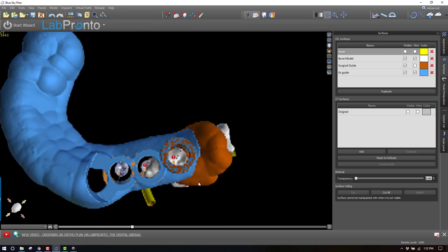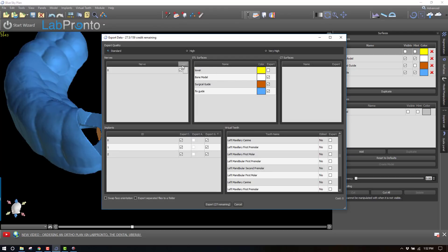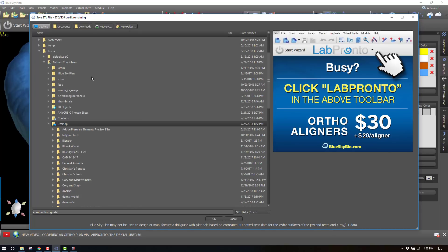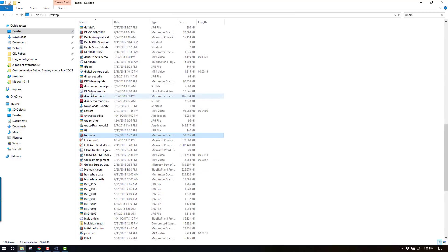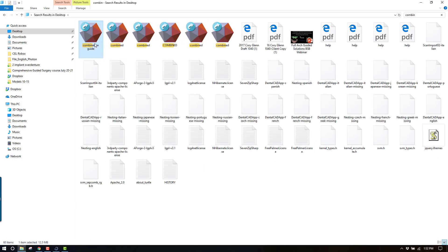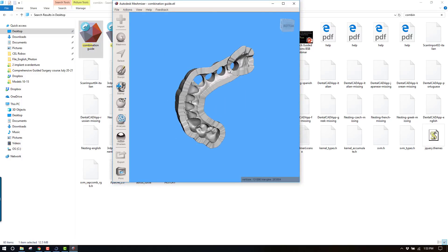Remember, they share the same common guide tube. So to combine these two, all I have to do is go to File → Export Data, and check everything off except for these two guides — the surgical guide on the bone and the other one I named. We're going to export these. I'm calling this the combination guide and saving it on the desktop. Now we can open this in Meshmixer or whatever program you like. Since we exported them together, they are now a single STL.